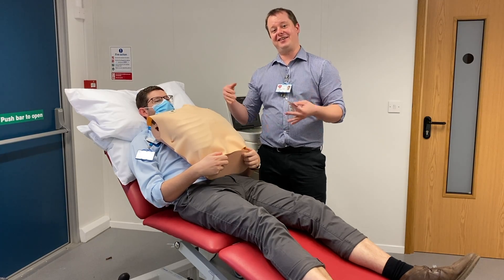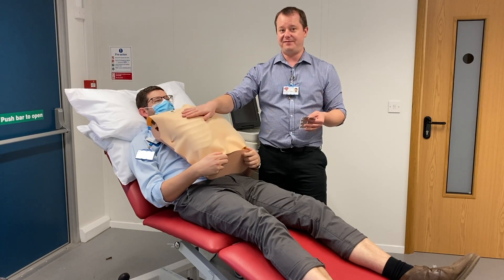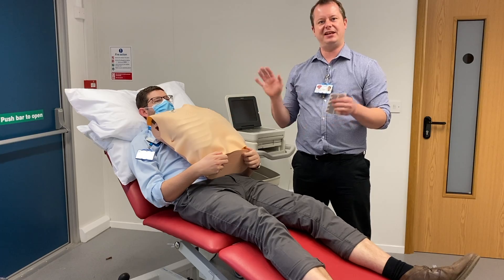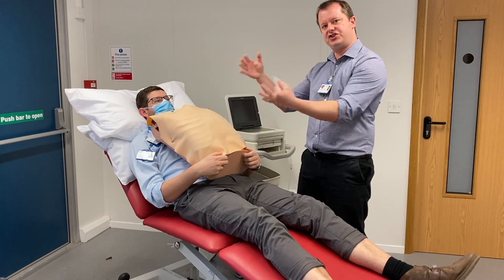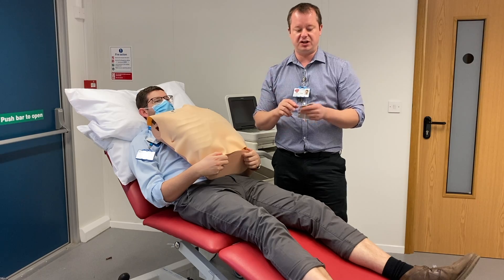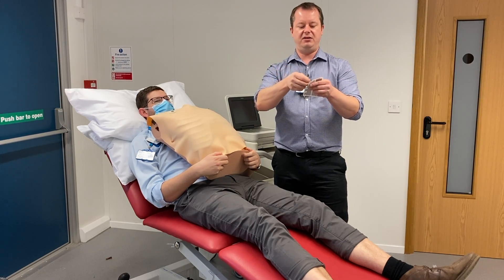We're now going to stick our stickers to James. As we can see, we have got our lovely fake chest on James and we can see lots and lots of ribs. We need to make sure we get into the correct position. You can stick these stickers on either limbs first and then chest second, or chest first and limbs second - it doesn't really matter. I'm just going to show you the limbs first.